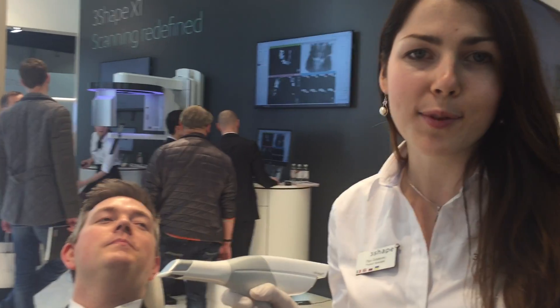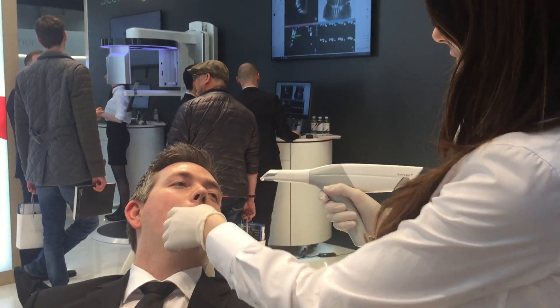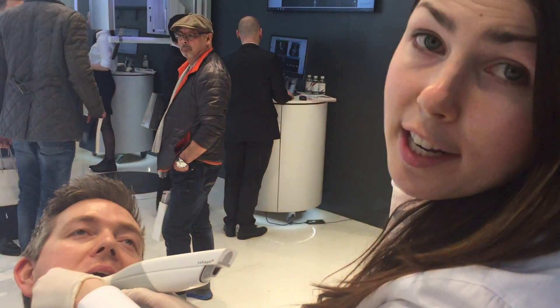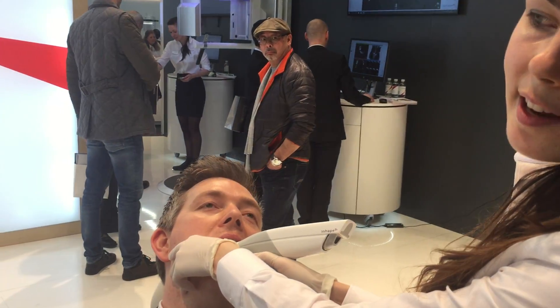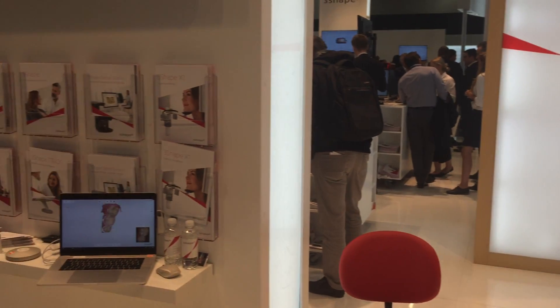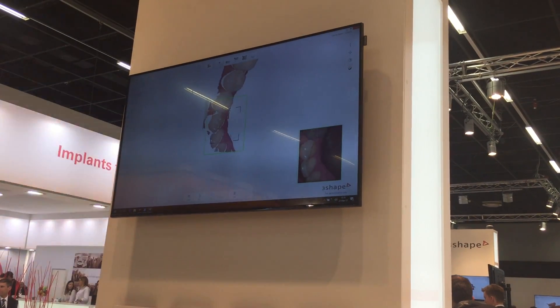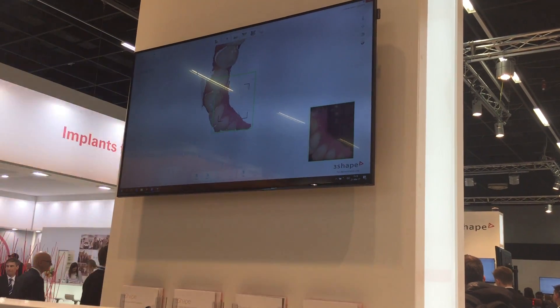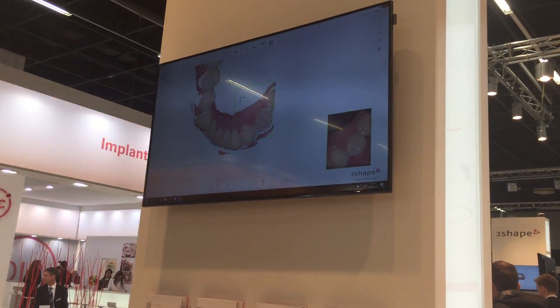So, we are going for live demo scanning right now. As you can see, this is a great patient experience because the scanning has never been as easy and fast before. Of course, it gets your digital impression in real color.